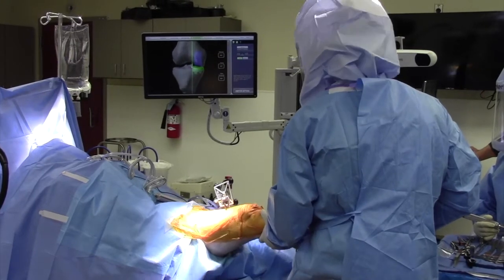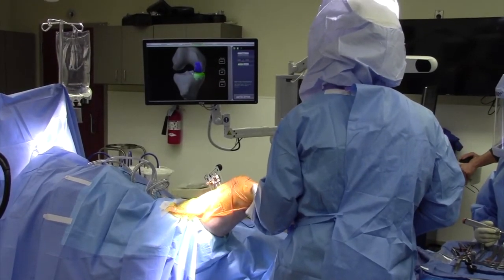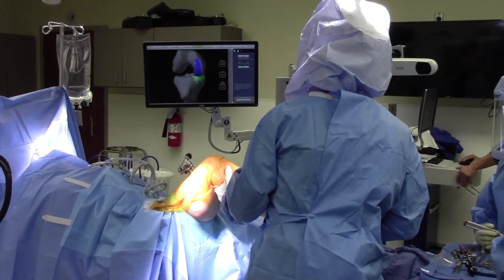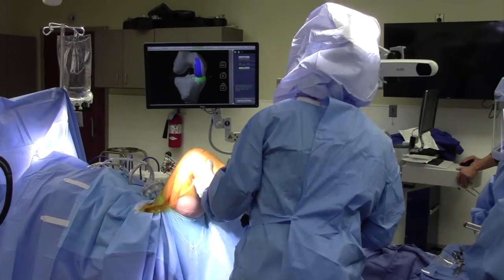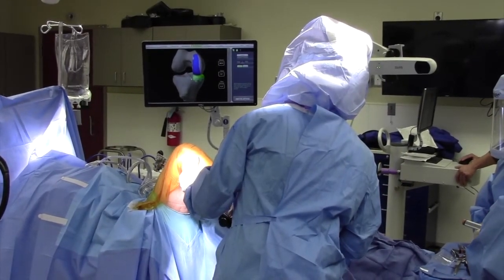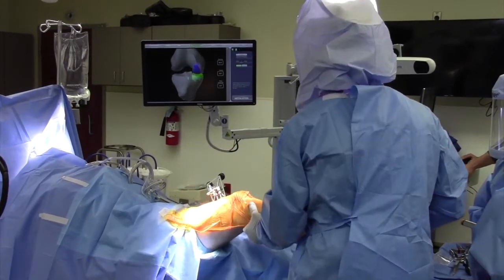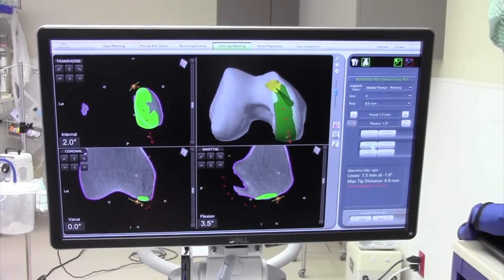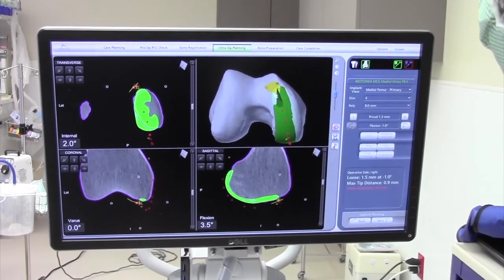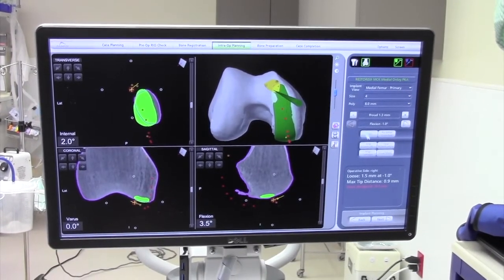Then we're going to assess the ligament balance of the knee through all ranges of motion. We're going to use that information as well as the information from cartilage mapping, which you can see here, to fine tune the position of the implants on our computer model.